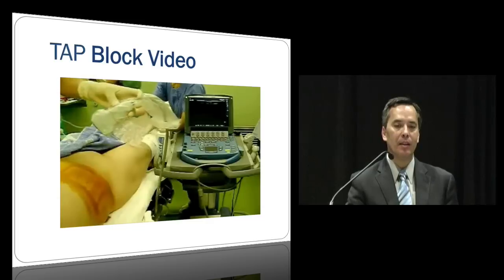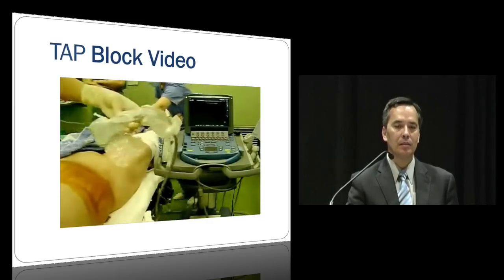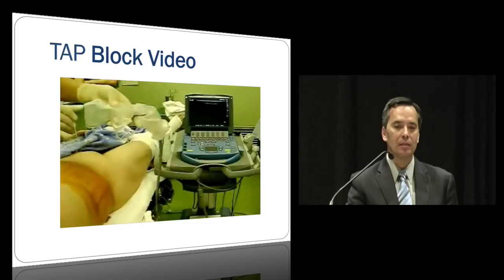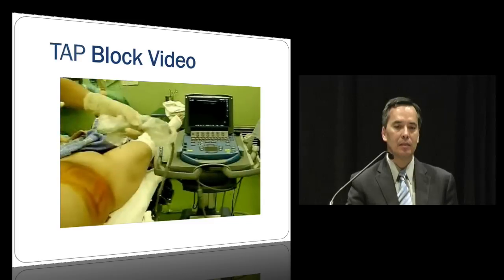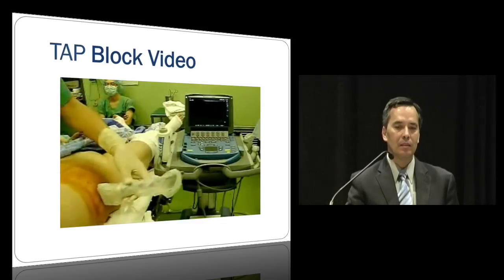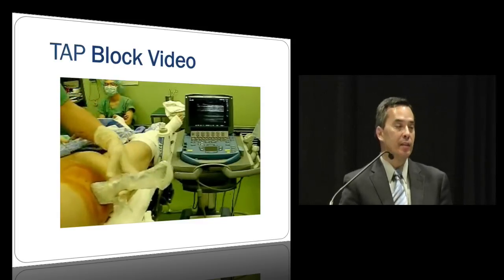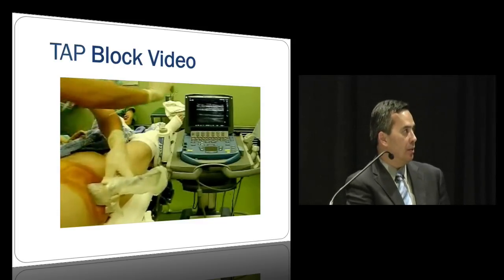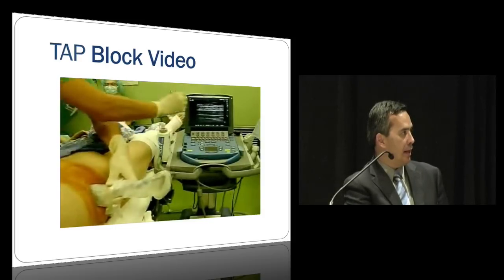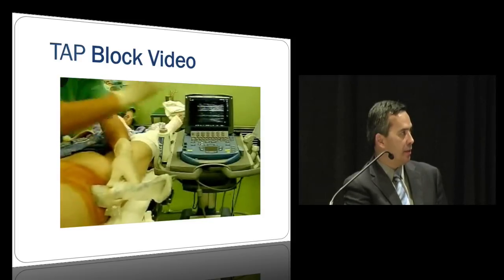Okay, so they're getting ready to. Okay, and that's on the side. And you can see the 3 layers that you want to look at. Stay away from down here, and pretty much in this area is where you want to go.